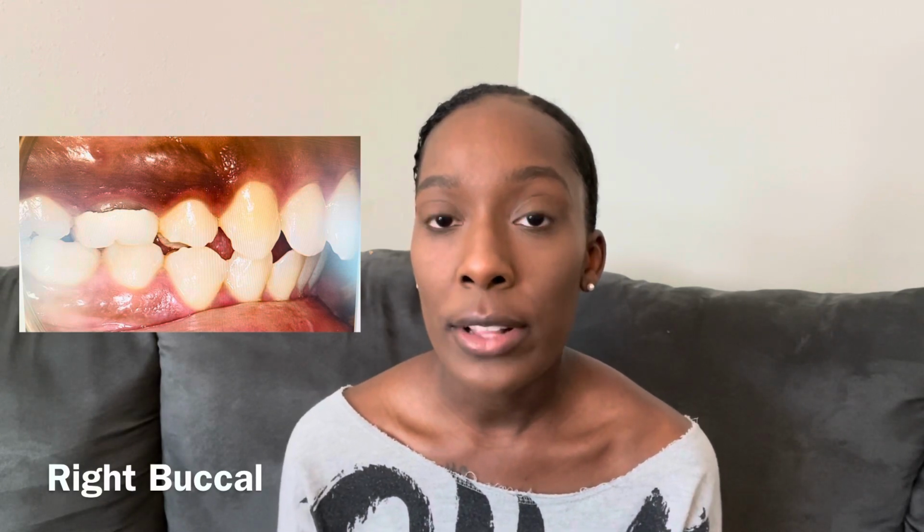The next intraoral is going to be the buccal. And in this image, we are looking at the right buccal. With the right buccal, we are looking to see how the upper right teeth are hitting the lower right teeth and seeing the class of the patient. And when I say class, in orthodontics, we reference certain bites with classes.